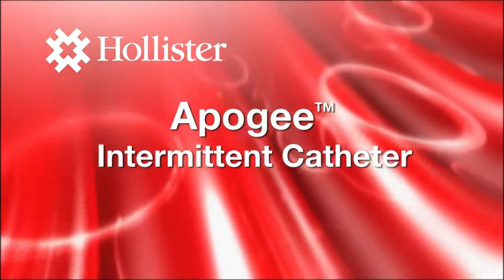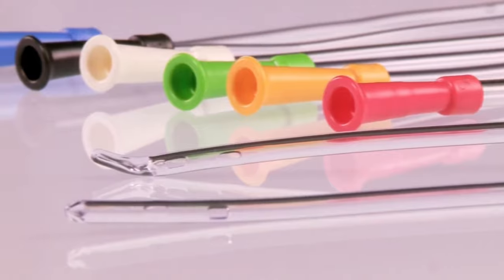The Apogee Intermittent Catheter from Hollister is a simple latex-free catheter designed to support mobility and independence.